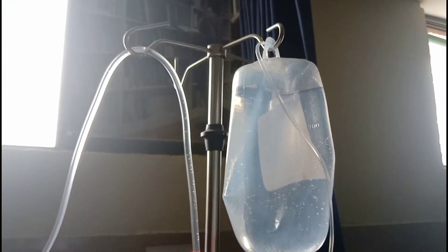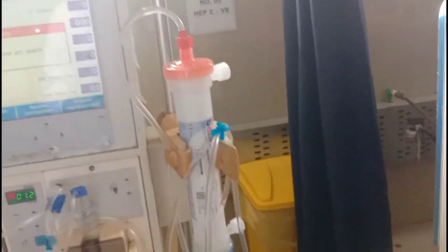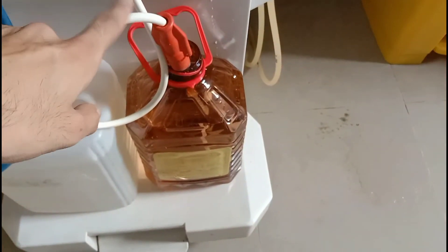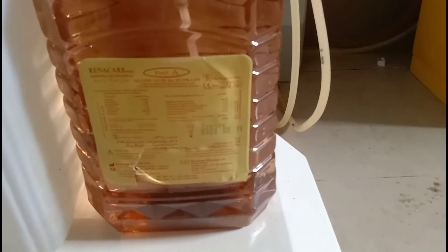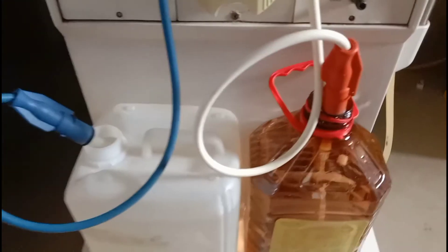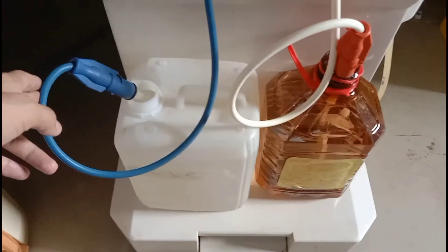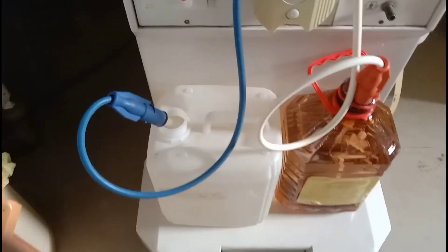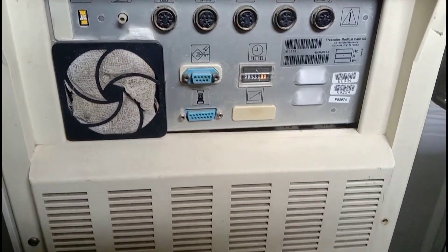Here are the dialysate connectors. This is the IV pole from where you can hang different materials during hemodialysis. Here is the dialyser of the extracorporeal circuit, and these are the two dialysate connector ports — one is red colored and one is blue colored. The red is put into port A and the blue is put into port B.